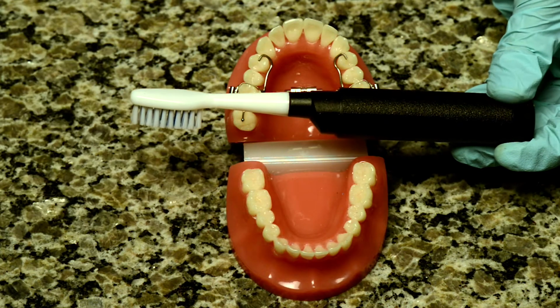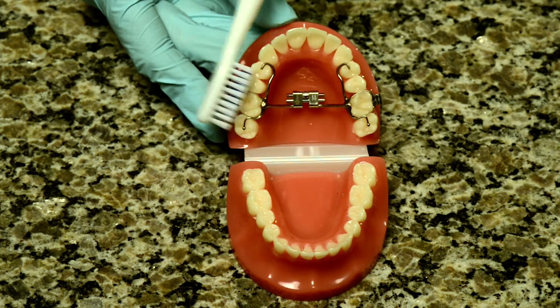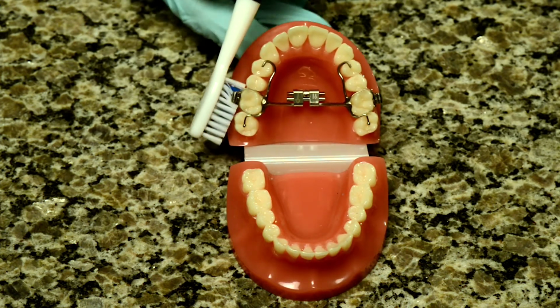After eating, you will need to rinse with water to get rid of the food that's stuck in the space in between the expander and the roof of your mouth. Be sure to brush 3 times per day, in the morning, after lunch, or when you get home from school, and then before bed. Use your toothbrush to brush your appliance as well as your teeth.